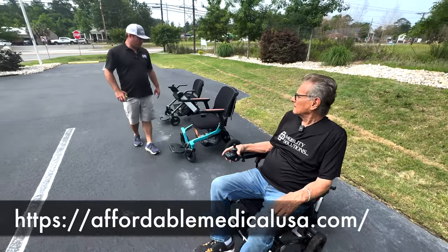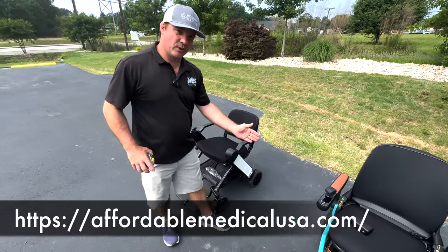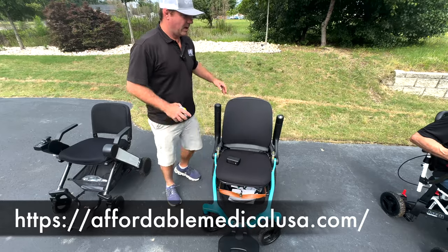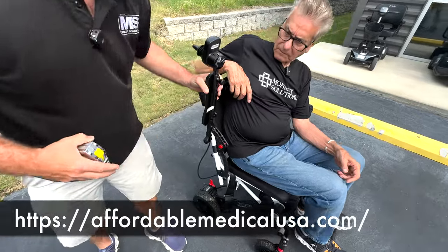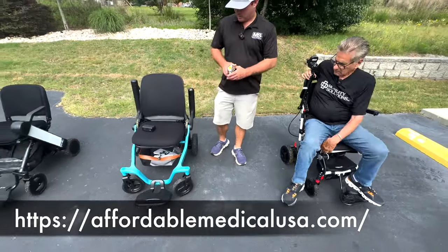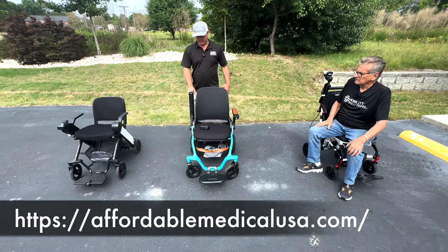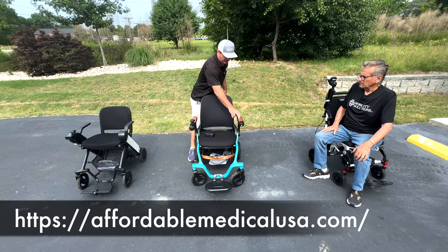I will mention to you really quick before we get into a lot of other stuff. These don't flip back. So if you're a transfer, you have to come out the front. If you had a transfer from right to left, can't do it. This one does have the arms that flip back, and so does the carbon. You can flip this back. So that's kind of a big deal. I will say that this one gets way out of the way compared to these two, so it's easier to get in and out. This one looks better to me. This one's Bluetooth. That one's Bluetooth. That one's not. So you can do a couple things in the Bluetooth app. This leather look or touch, I don't know if that's real leather or not, but it feels really nice.